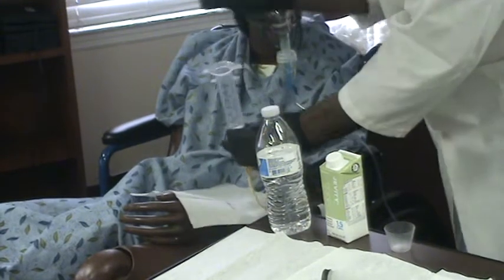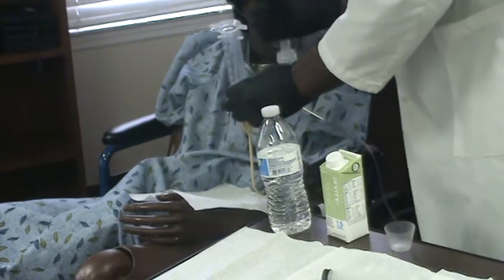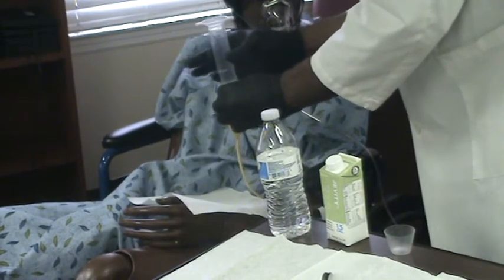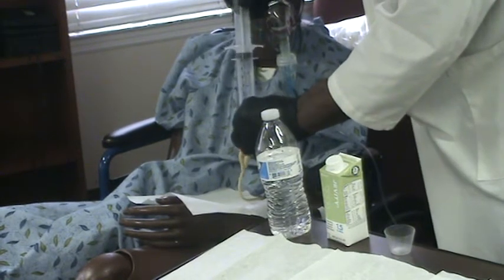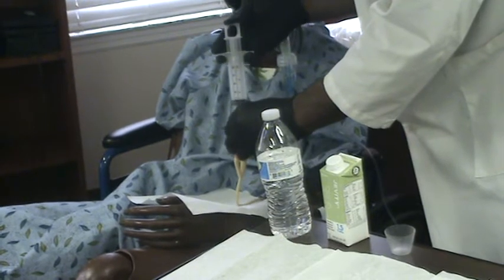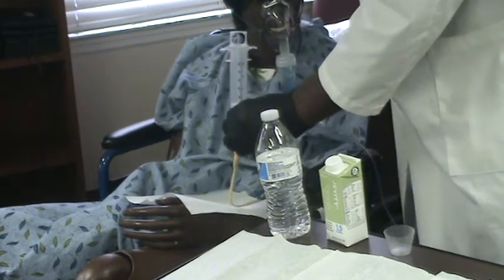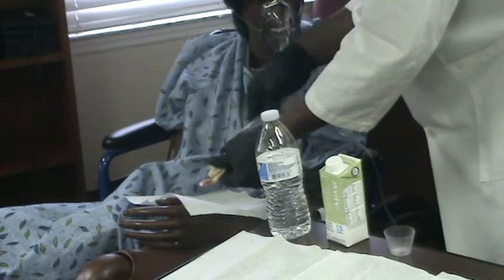Then you have your cup of water, and you pour it in here. Then let the water go by gravity to flush. If it doesn't go, say it's stuck, just gently push it down, then it will go. When you're taking this out, don't pull it out, otherwise you're going to pull back what you just pushed in. Bend it first. Take this out.